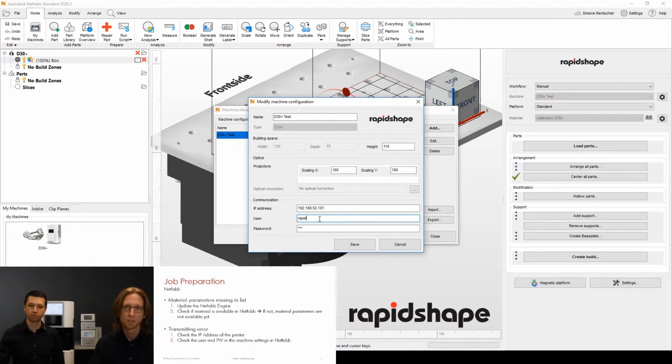So the last possible reason for a transmitting error would be the wrong password. We won't share the password here in the webinar, but you can be sure that you can find the password in the machine's manual. So what happens also quite a lot, let me just enter the password real quickly. What is also happening a lot is that a customer is using the correct password, but has maybe caps lock active, or is maybe using a capital letter at the beginning or somewhere in the middle. So in this case, if I have a service case and I go online via TeamViewer on the customer's PC, I just enter the password on my own, cross-check if the job transfer is working. Normally, like 80–90% of the time, it is working then. So make sure that the correct password is inserted.